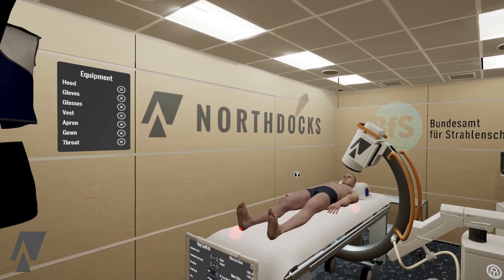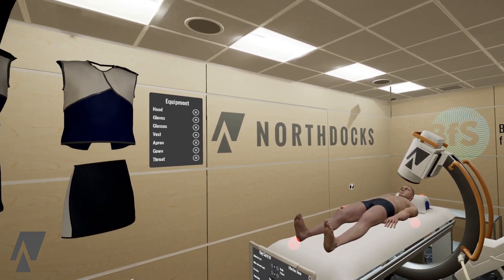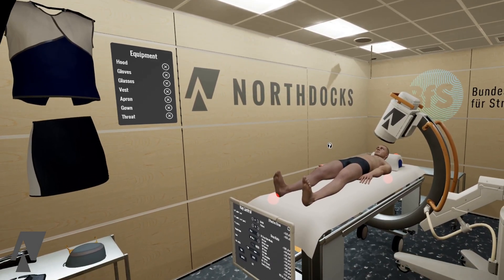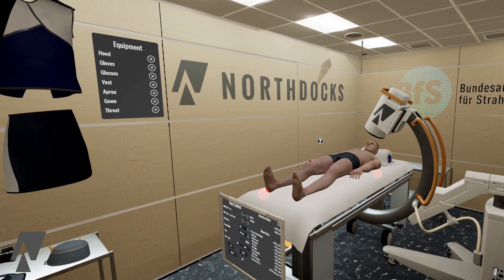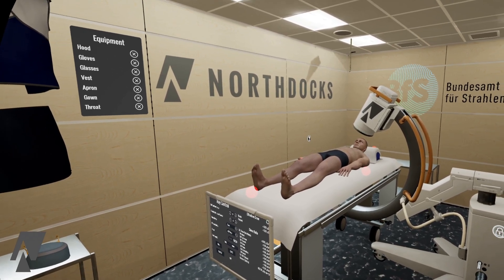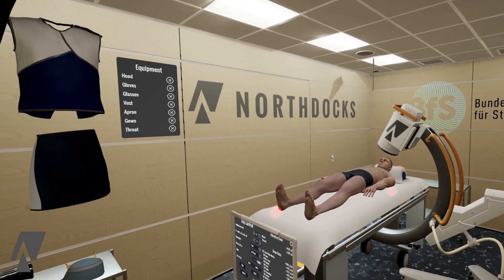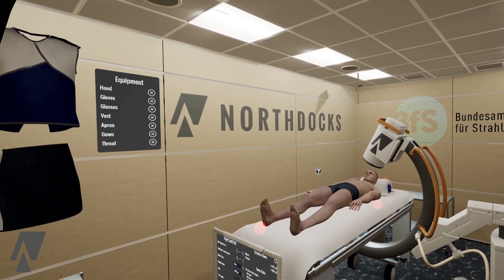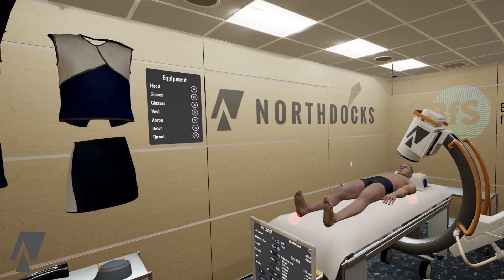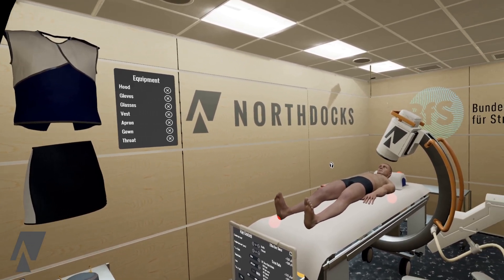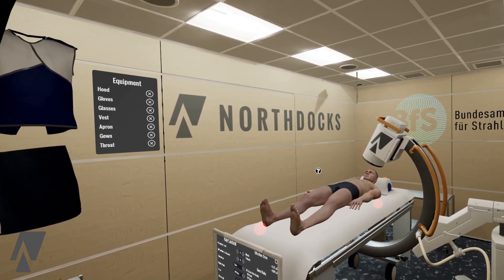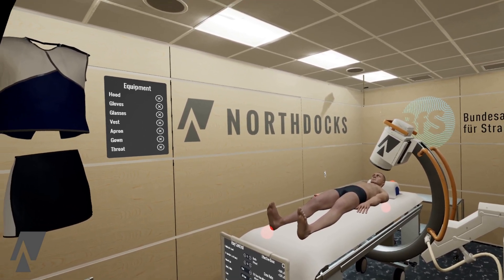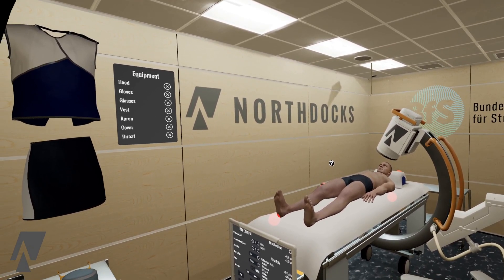Welcome to this quick demonstration of our radiation protection virtual reality application. I will quickly demonstrate the most important features for you to make up your own mind if you're interested in using this for education purposes.